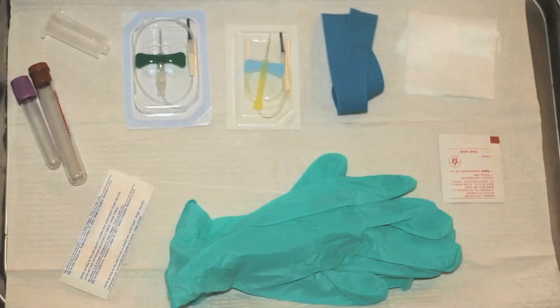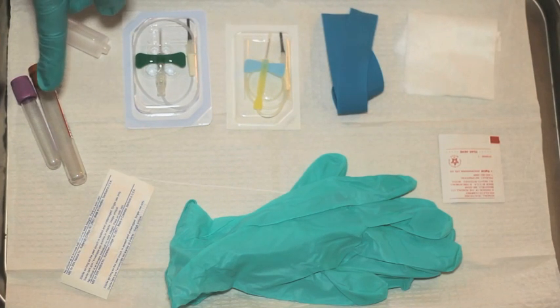Begin by gathering all appropriate materials that will be required beforehand. This standing tray has been covered with a clean disposable apron and prepared to include everything that will be needed.